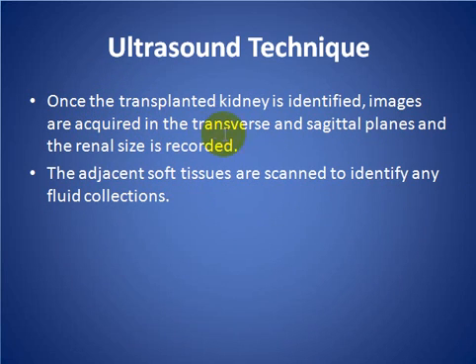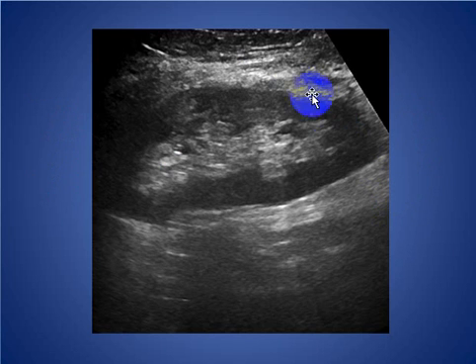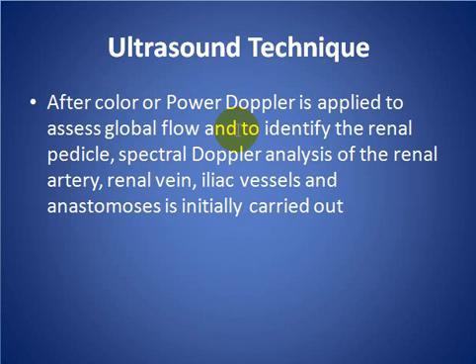Ultrasound technique: once the transplant kidney is identified, images are acquired in the transverse and sagittal planes and the renal size is recorded. The adjacent soft tissues are scanned to identify any fluid collection. Here you can see the transplanted kidney with the renal sinus, cortex, and differentiation between cortex and medulla. Color and power Doppler are then applied to assess global flow.